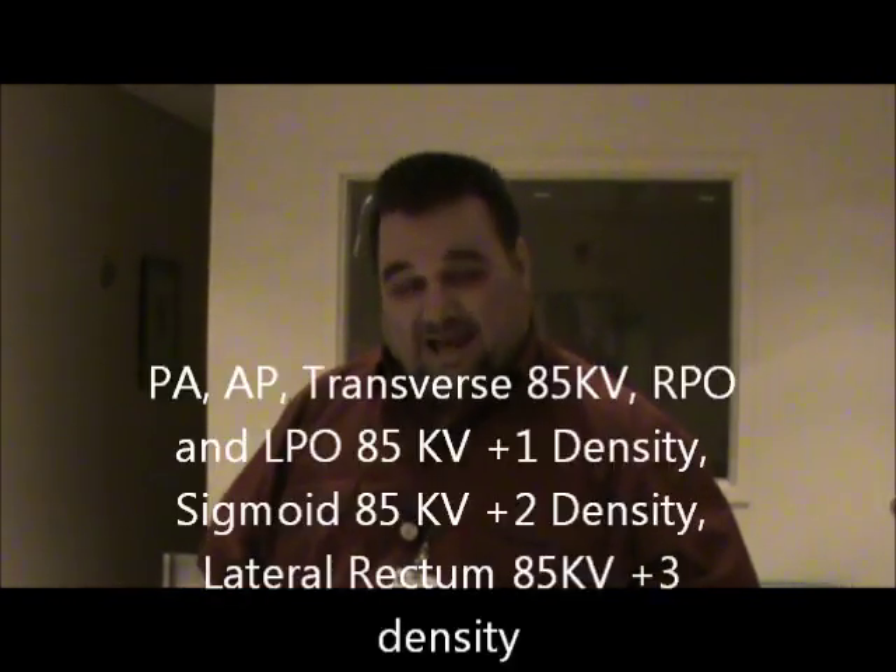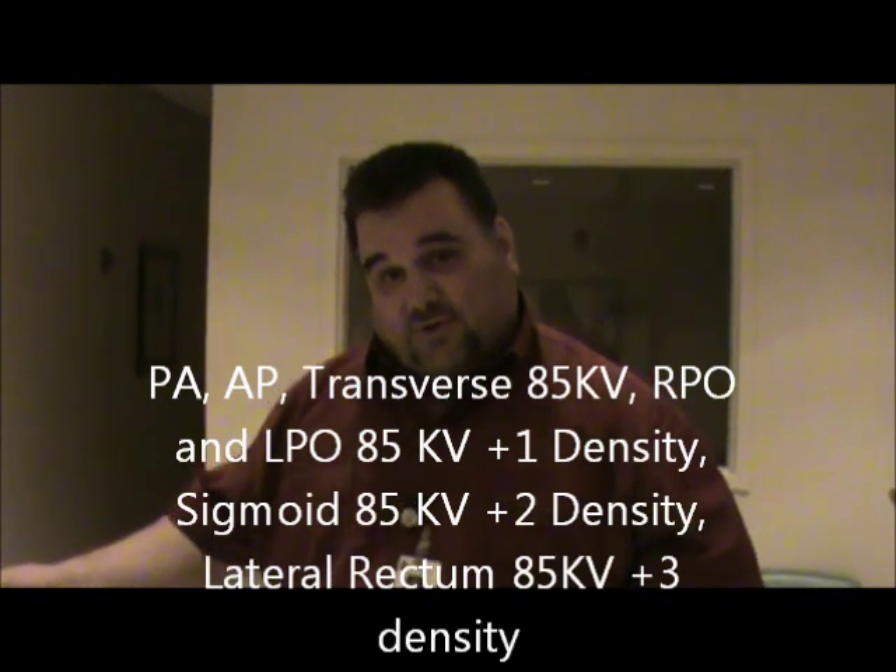The next view after the PA would be the AP. On the AP, you center a little below the crest; on the PA, we center at the level of the crest. The technique changes with air because air is a lot less dense than barium. For the air BE, the technique will be about 85 kV. For the AP and transverse, it's 85 kV center cell. For the obliques — RPO and LPO — it's 85 kV plus one density. For the sigmoid, it's 85 kV plus two density. For the lateral rectum, it's 85 kV plus three density. What changes from air to single contrast is the kV, not the plus density steps, because air is less dense and requires less kV to penetrate the patient.